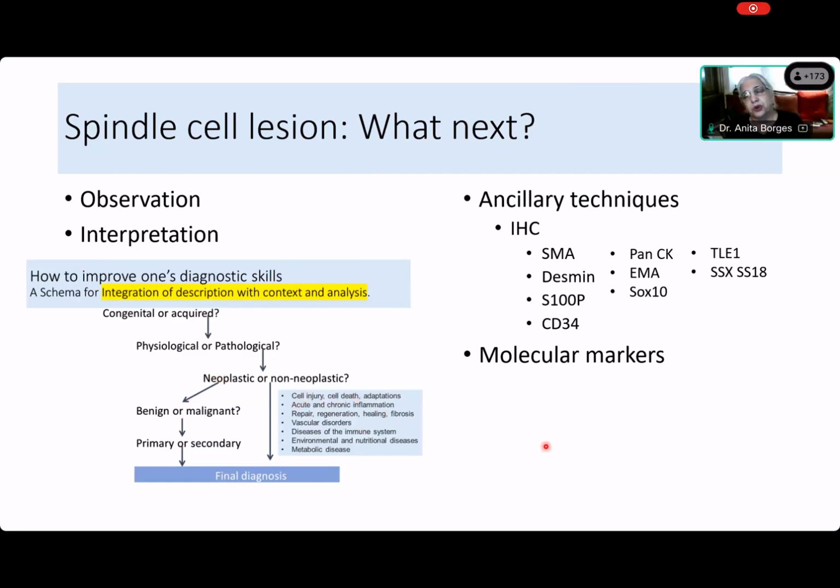Okay, this is how we make any diagnosis, and the same thing applies to spindle cells. If you have a tumor and you're not sure what you're dealing with, sometimes you have to resort to ancillary techniques. It's not required in every case. In fact, we overuse a lot of immunohistochemistry because we are trying to get over our own lack of confidence. But that's not a good way to use immunohistochemistry.